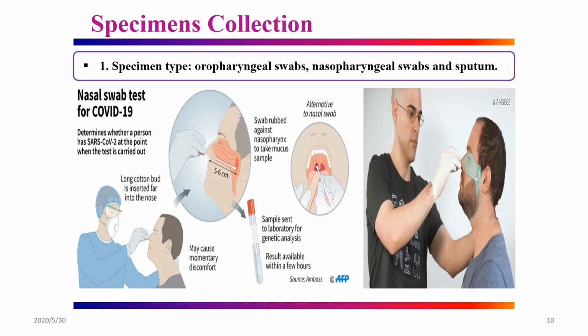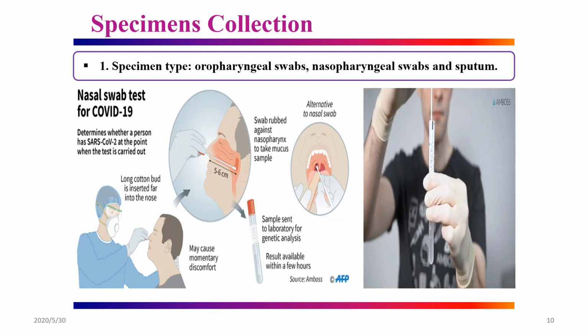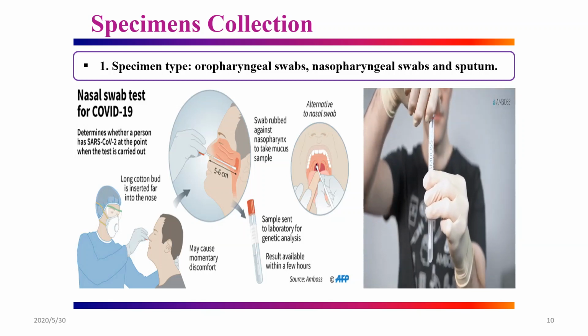When collecting samples from an adult patient, this corresponds to a travel distance of approximately 5 to 6 centimeters or 2 inches. Leave the swab at this depth for a few seconds while gently wiping the wall by twisting the swab shaft. Slowly and gently remove the swab. Immediately insert the swab into the sample collection tube, which may contain 2 to 3 milliliters of viral transport media.